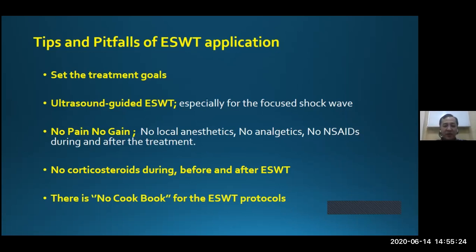And then, no pain, no gain. We have to educate the patient. It will be painful during the treatment and after the treatment. But no local anesthetic here, no analgesics, no NSAIDs, non-steroidal anti-inflammatory drugs, during and after the treatment, because we want to activate the sensory fibers and substance P. So don't use local anesthetic, don't use analgesic NSAIDs during and after the treatment, so we can also follow up the effect of the shockwave. So don't give pain relief drugs.